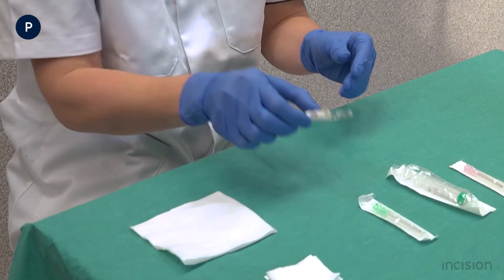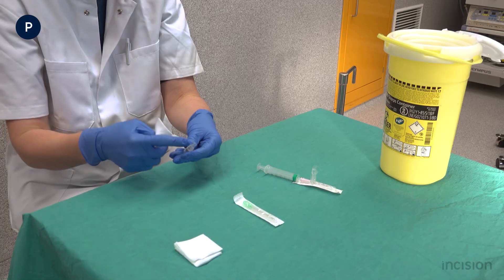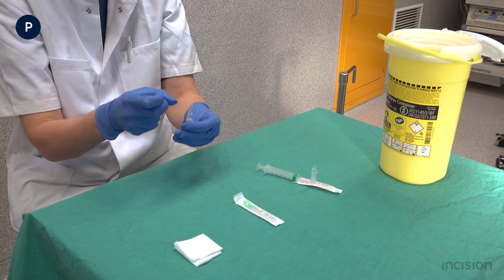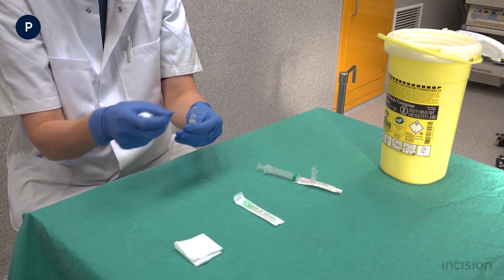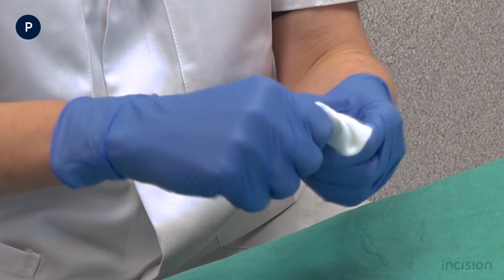The ampoule is inspected to confirm the correct medication, dosage, and the expiration date. To open the ampoule, the medication that is in the narrow top section of the ampoule is removed by gently flicking it. Subsequently, the ampoule is opened using a gauze swab.